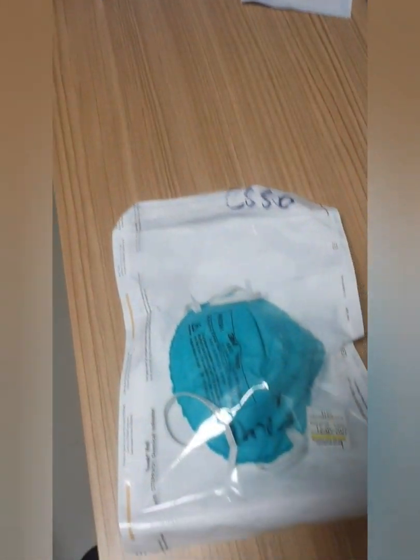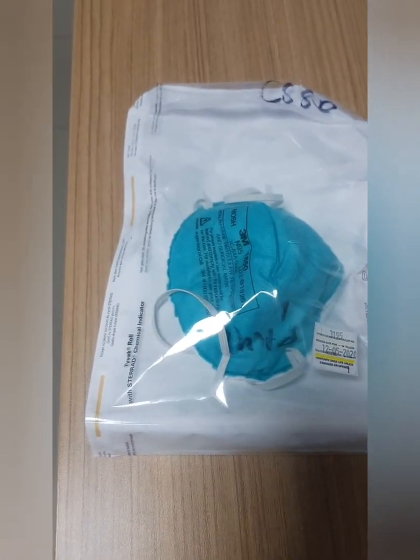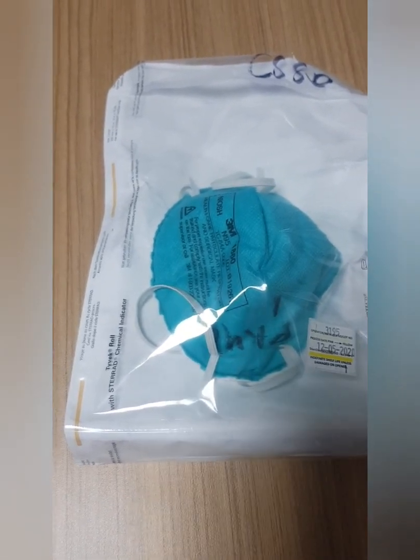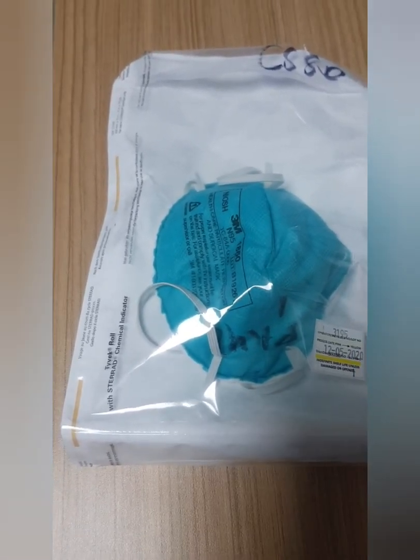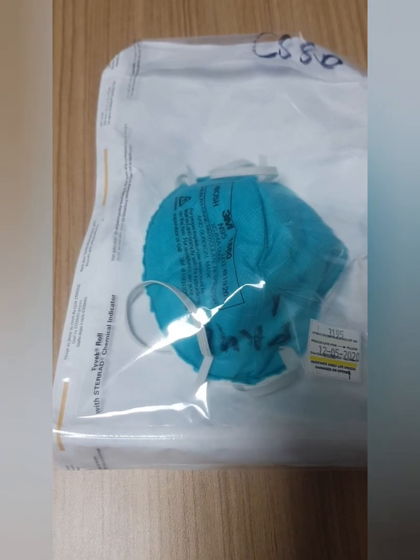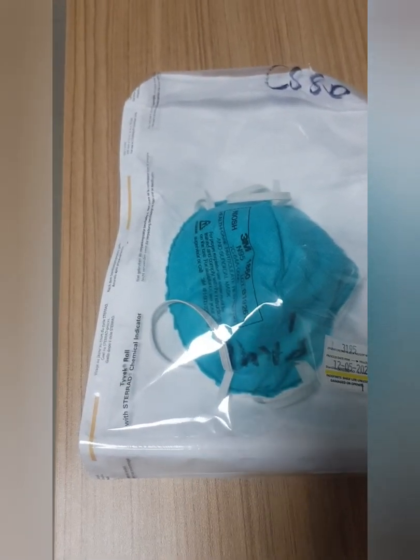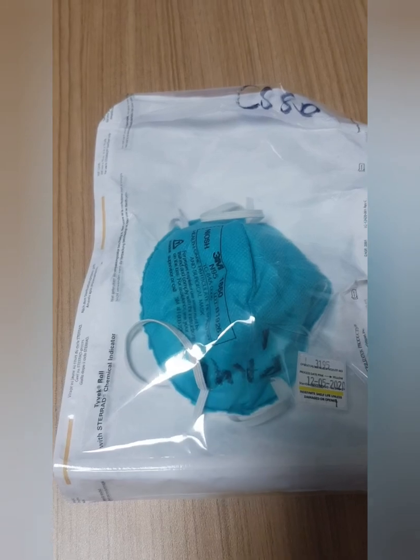On the side, my name and the number of use. So for reprocessing of N95, according to the guidelines that the government has provided, you can only reprocess or reuse an N95 after 2 uses. After 2, you need to dispose of it already. Anyway, there's no clear definition of how much reprocessing should be done or is allowed, because reprocessing of N95 on a regular basis in the real world is not allowed. But since it's the pandemic and most of the hospitals don't have stocks, reprocessing of N95 should be done.